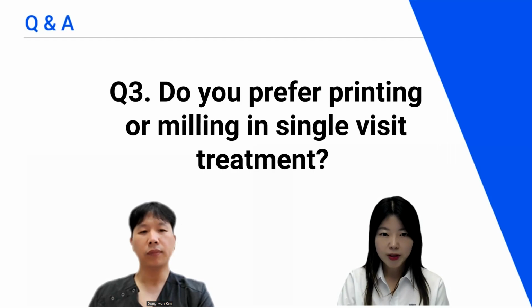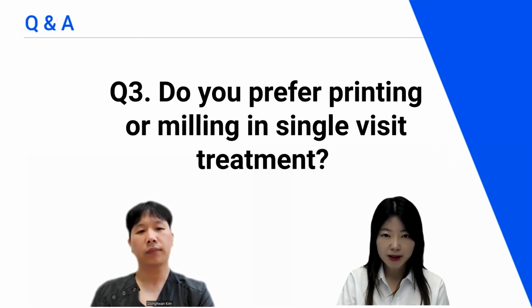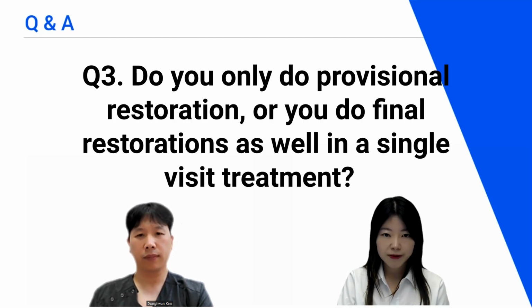Okay. Question number 3. Do you prefer printing or milling in single visit dentistry treatment? Do you only do provisional restoration or do you do final restorations as well in single visit dentistry treatment?